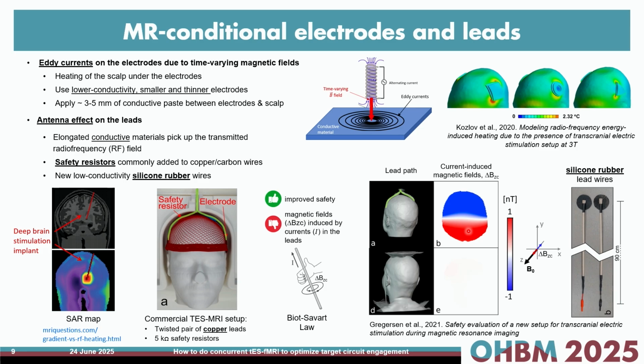So we no longer need to avoid contact with the patient, and we can bring the cables straight along Z in order to avoid these undesired magnetic fields. Of course, depending on where you want to put the electrode, you will not always be able to avoid some bending, and so some of these undesired fields can induce distortions, which is what we're about to see.